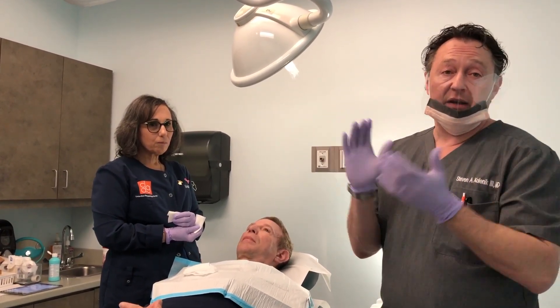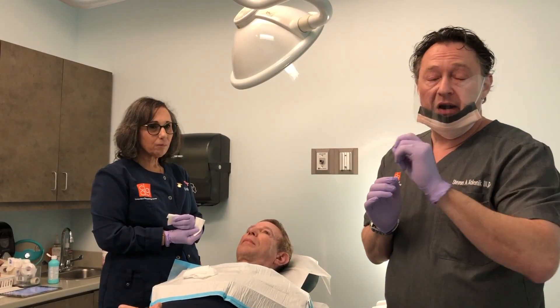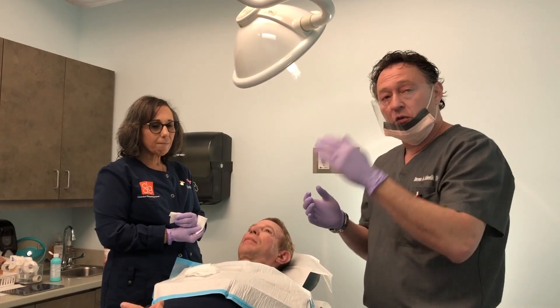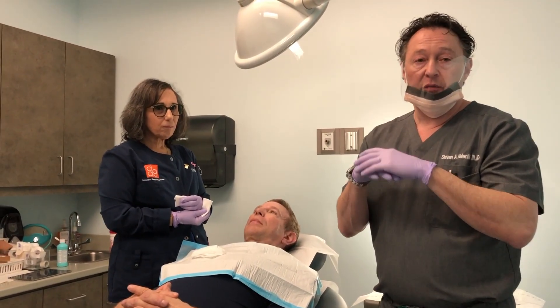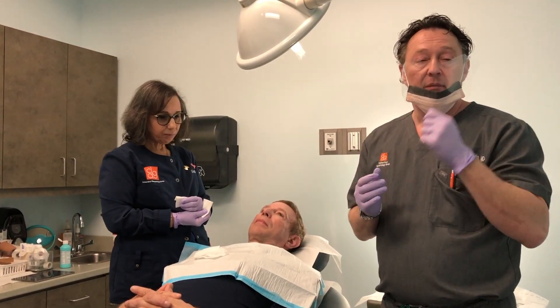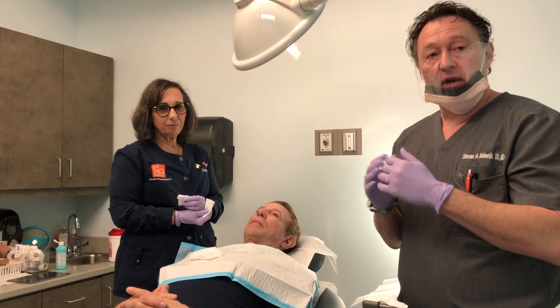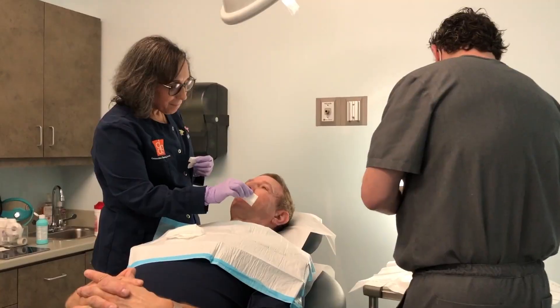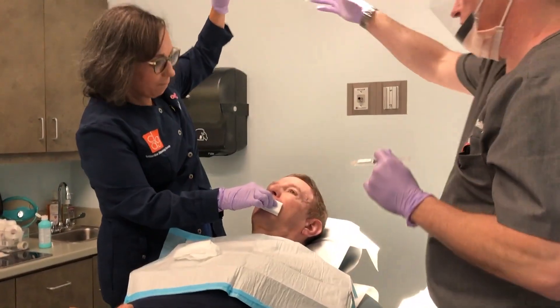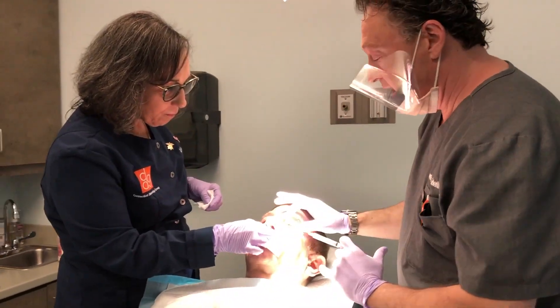If it's clear, he's done — that's great. If there's tumor anywhere around the edge, we'll bring him back in the room, take more tissue, which will be studied in the same way. And when we know the tumor is out, we will repair the area with a little minor plastic surgery. So we're going to get started. First part, of course, is to numb the area with a little lidocaine.